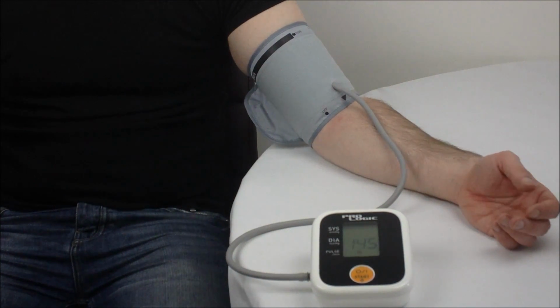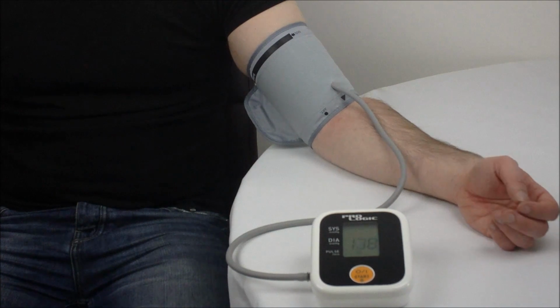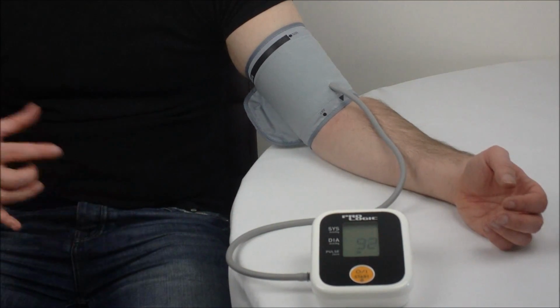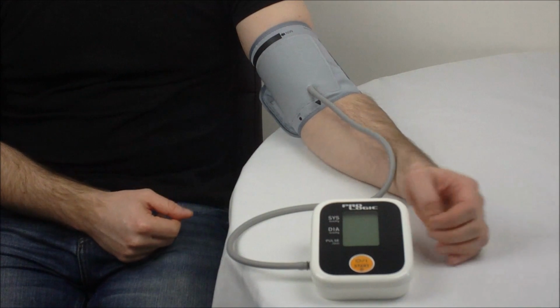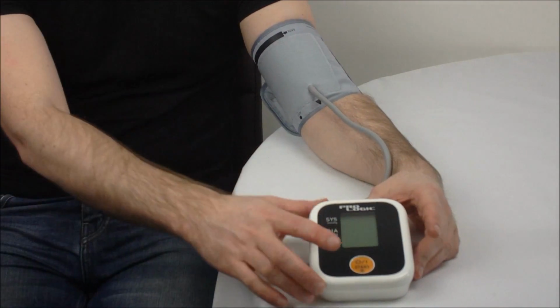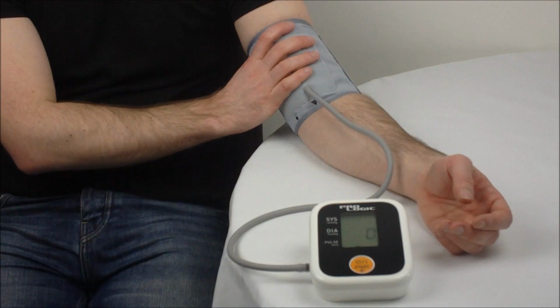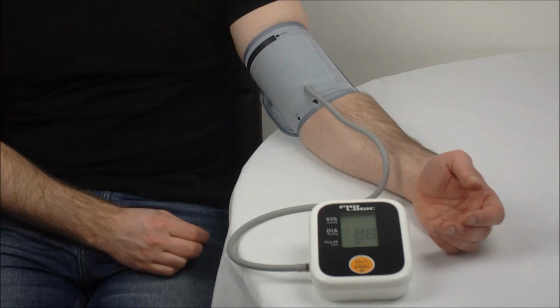Now it's important that you take your blood pressure measurement under the same conditions, so things like the time of day can affect your blood pressure. So always try and take your blood pressure roughly at the same time each day. So for our final measurement then, we're just going to repeat the procedure again and write down the results. Again, just press the middle button to start the compression and you'll feel this tighten. And you should get a blood pressure measurement at the end of it.